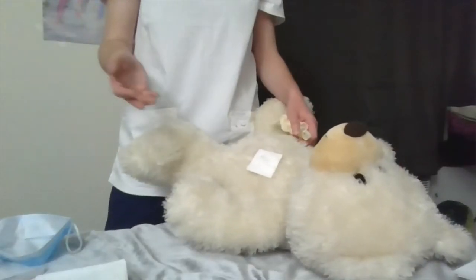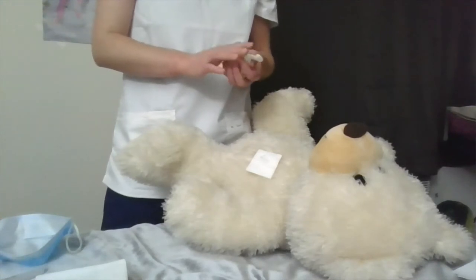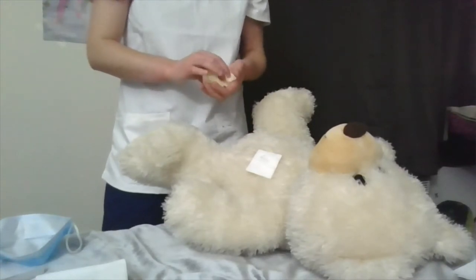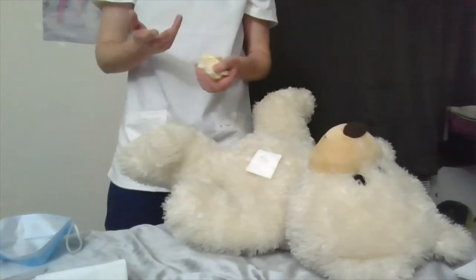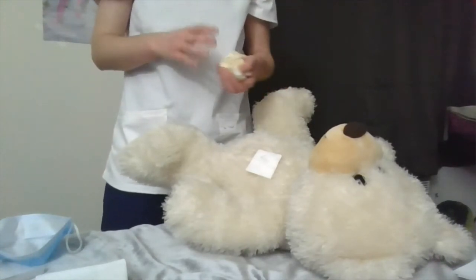Right now I'm going to be demonstrating how to change a central line dressing, and I'm going to assess the central line site.